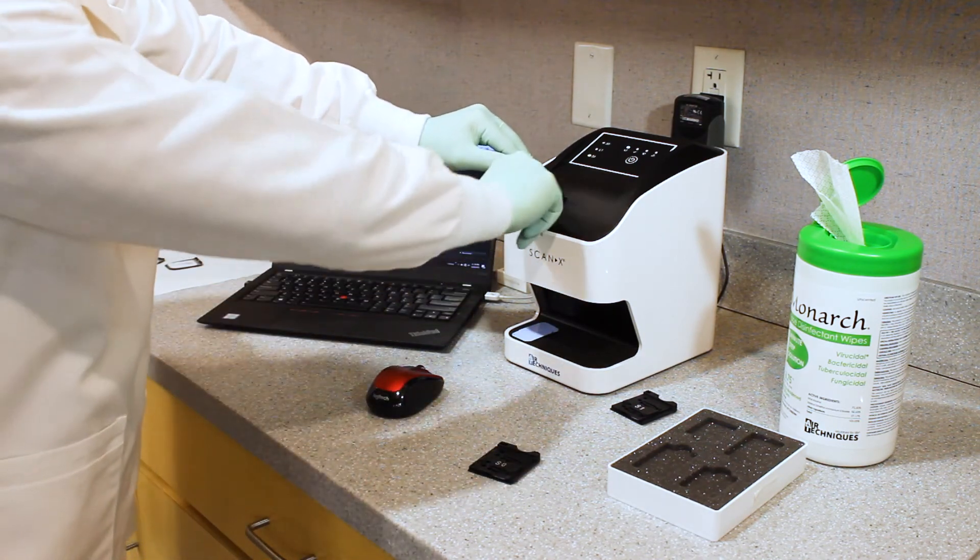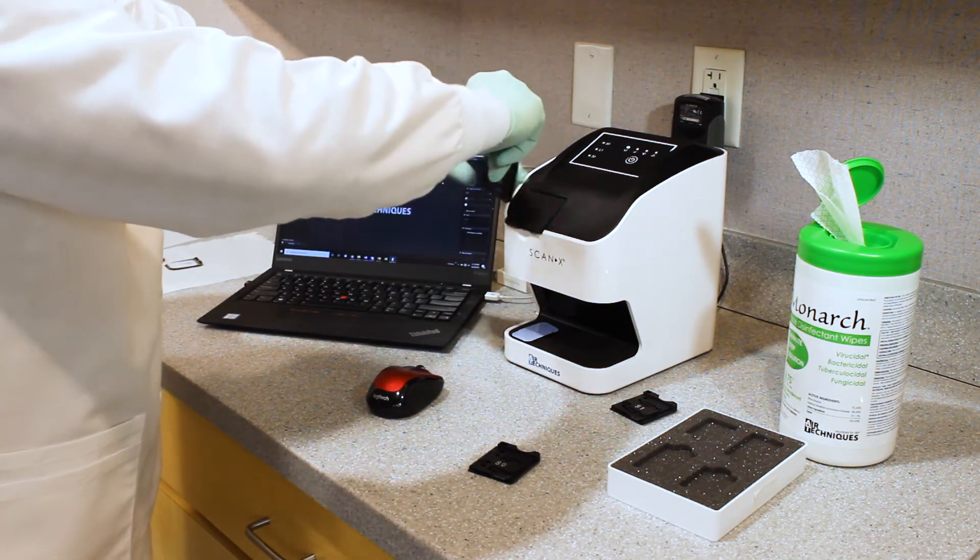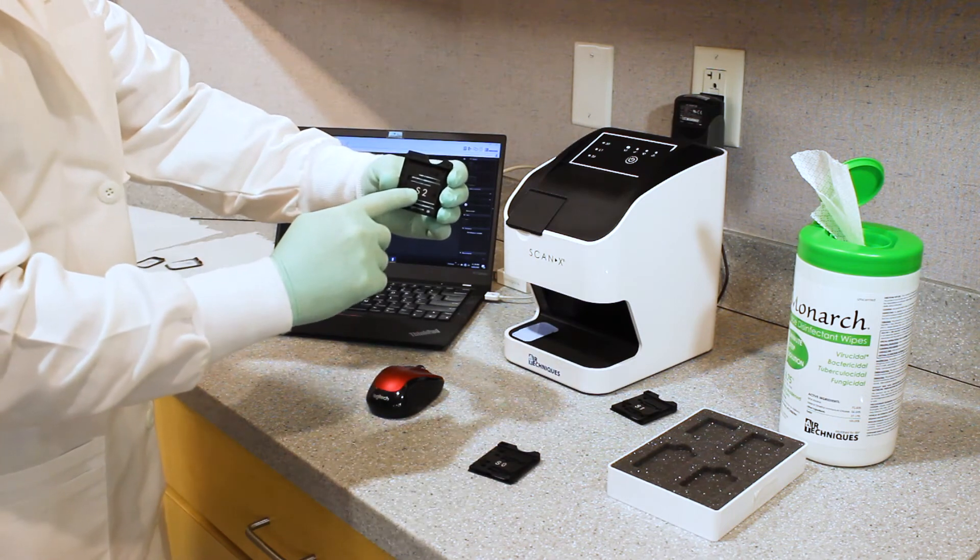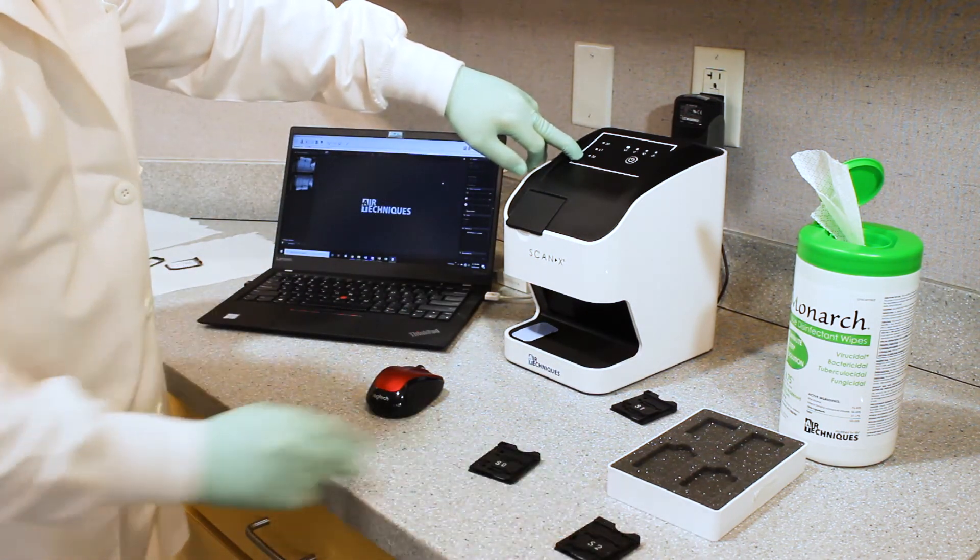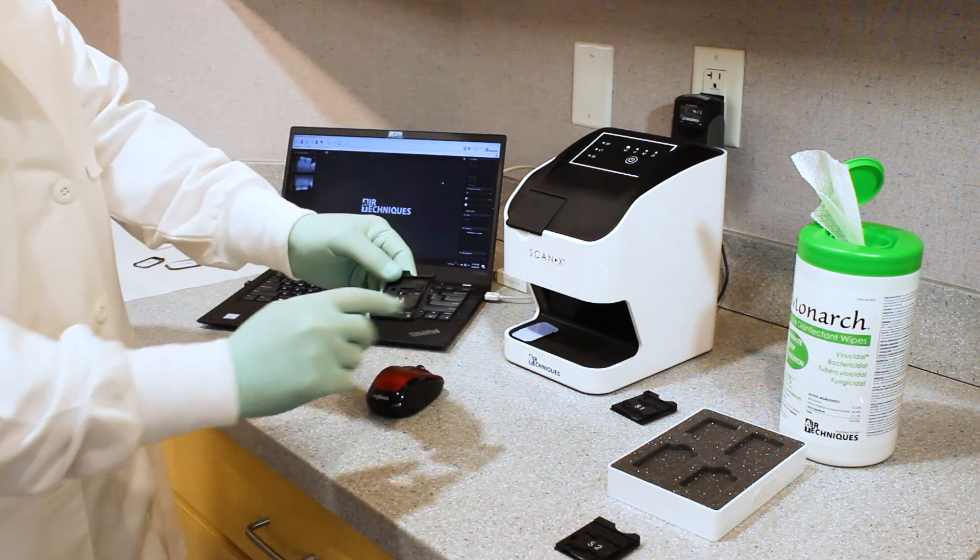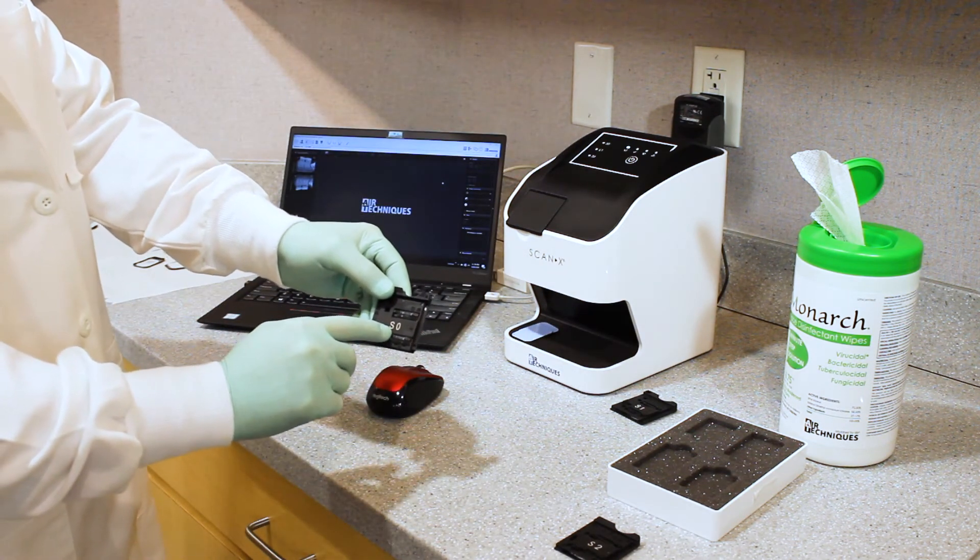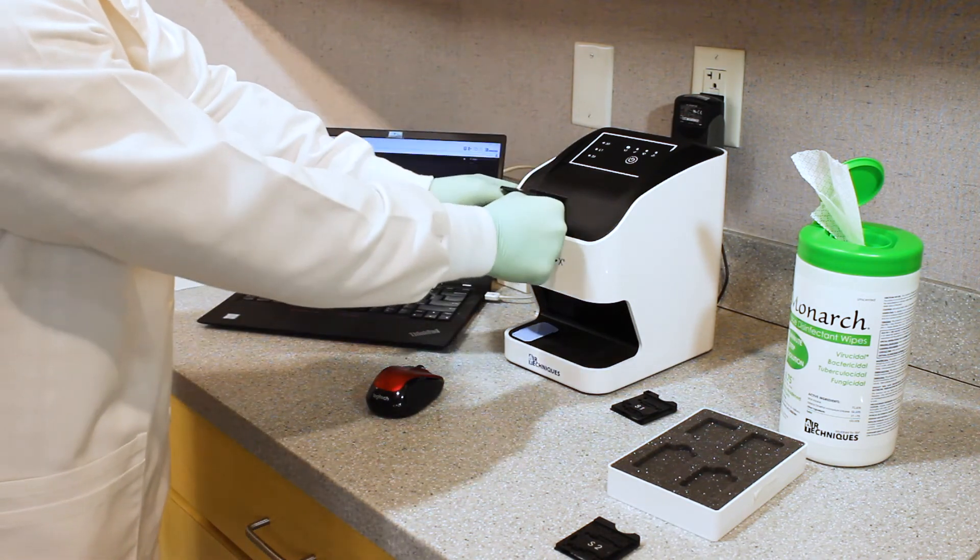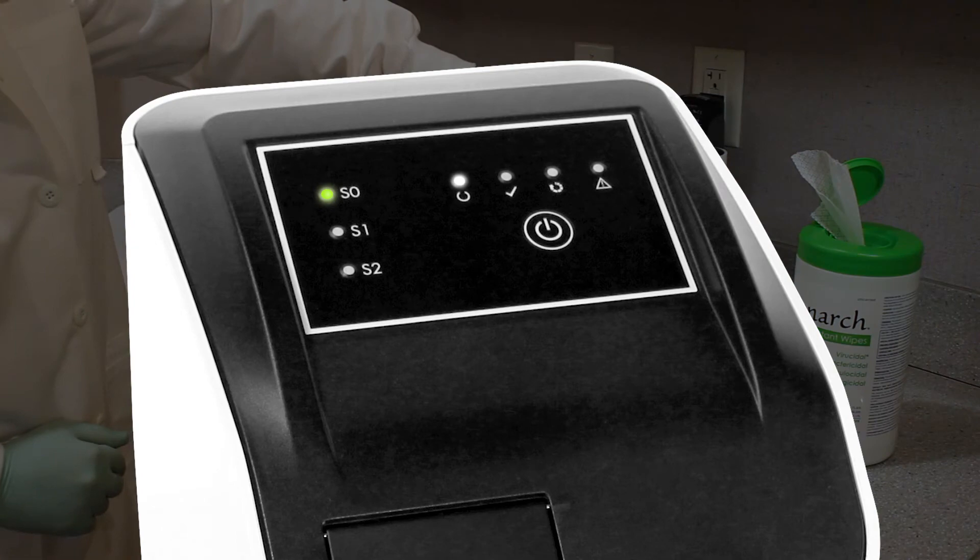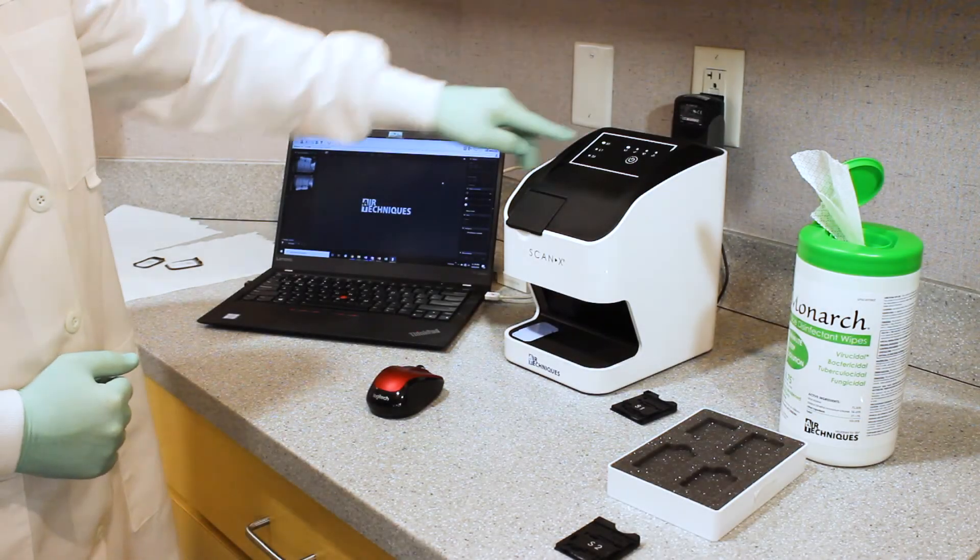So for this, I'm going to take the size number two cartridge out. And you'll notice the LED on the S2 is now turned off. And we will take the size zero or S0 and insert that into the scanner. And in doing so, it now indicates and it knows that a size zero cartridge has been inserted into the machine.